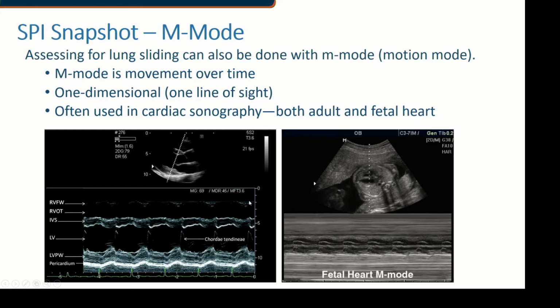So you'll notice that the next layer is just black. And then the layer after that, as we hit the interventricular septum, becomes all in varying shades of gray again. And then we hit the left chamber, and we should be hitting black again. There's some echoes within there because remember this is motion, and so the chordae tendineae happens to be at the level of this particular line, and so that's demonstrated.